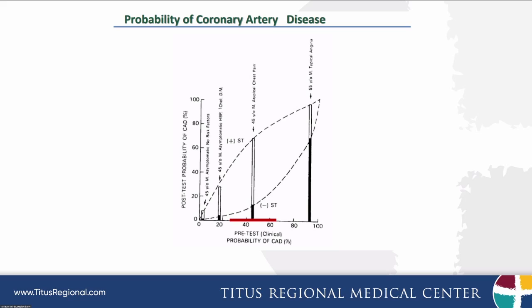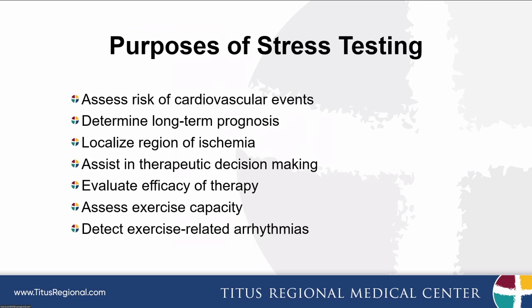That's, for example, why we don't just do stress tests on everybody to look for disease. We have to think about the situation itself and what the stress test is going to tell us. So there are many purposes we have for doing stress tests.